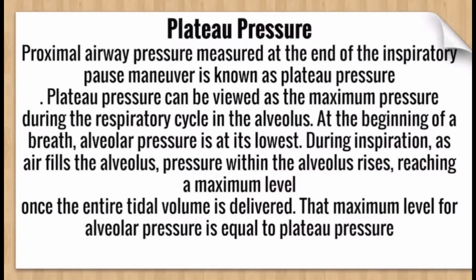Plateau pressure can be viewed as the maximum pressure during the respiratory cycle in the alveolus, so it is purely related to the alveolus. At the beginning of a breath, alveolar pressure is at its lowest.